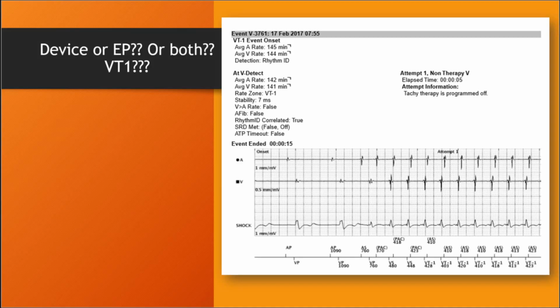So, let's start with this example. You might have seen something similar like this before. Let me call up my laser pointer. So, the arrhythmia report here is telling us that we have an episode of VT. But straight away we look down here and we notice that the atrial and ventricular rates are around the same, 144 to 145 beats per minute, 141, 142 beats per minute.